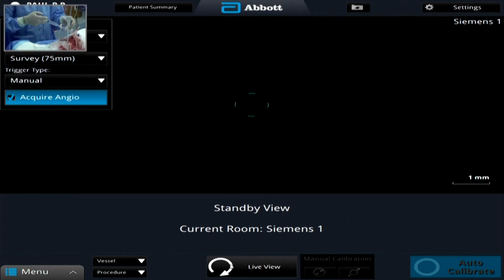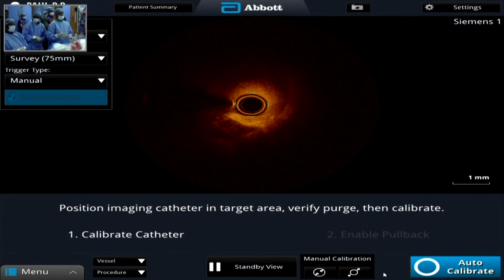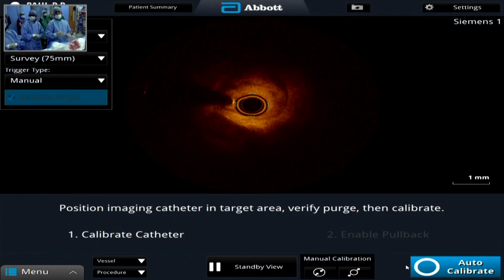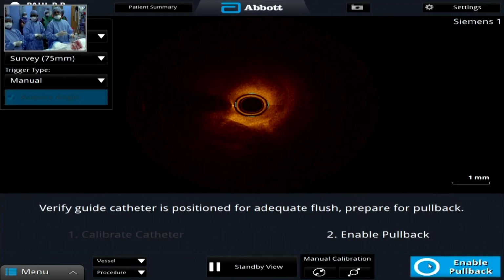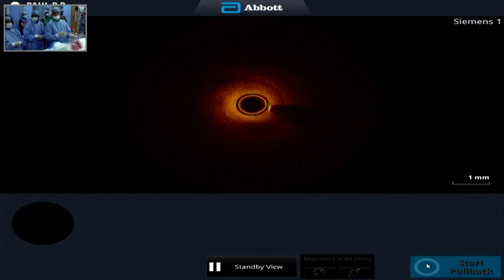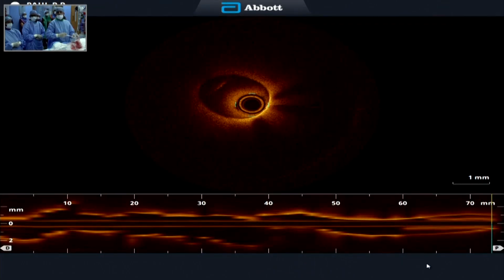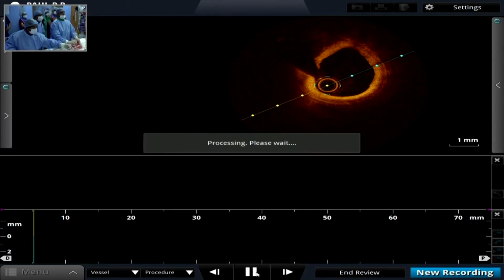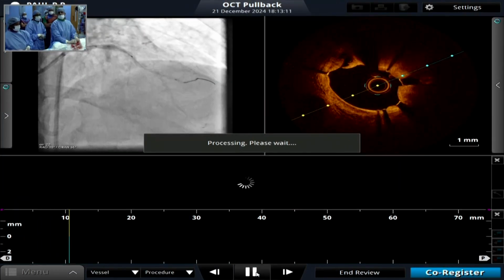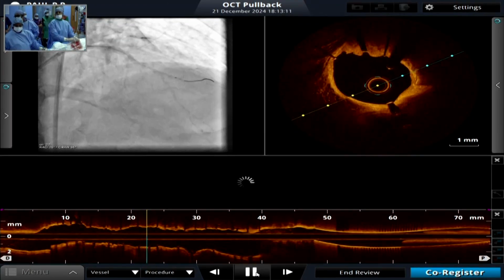Okay, we are ready. Yes. 50-50. Good. We'll do final images and come out.